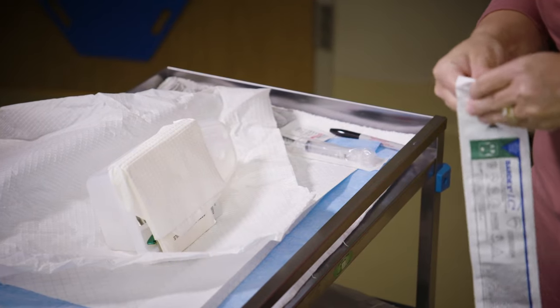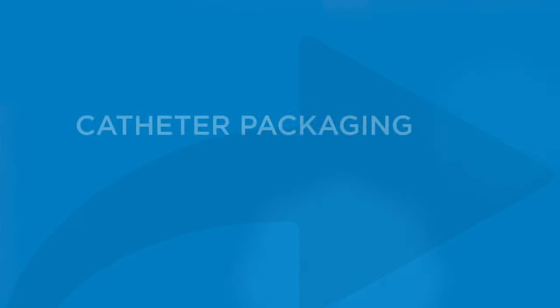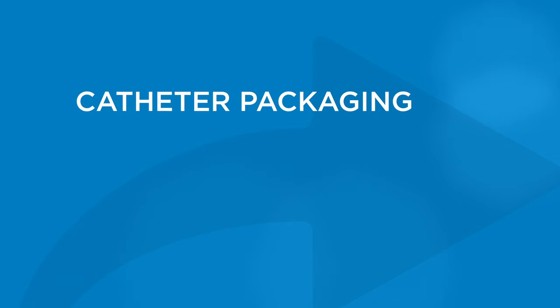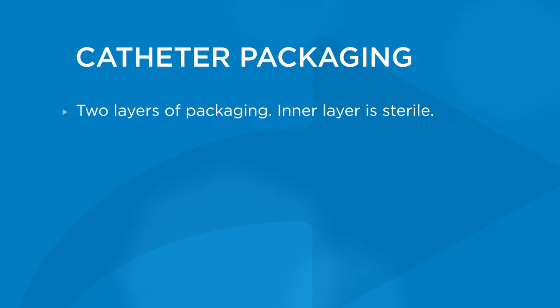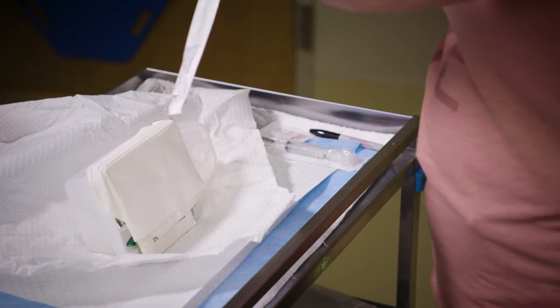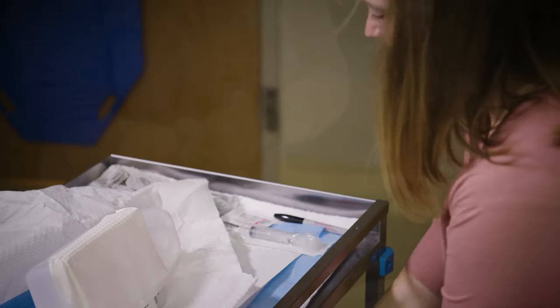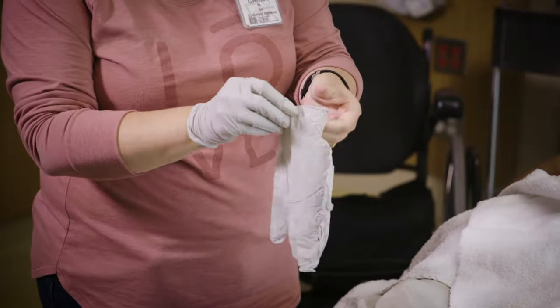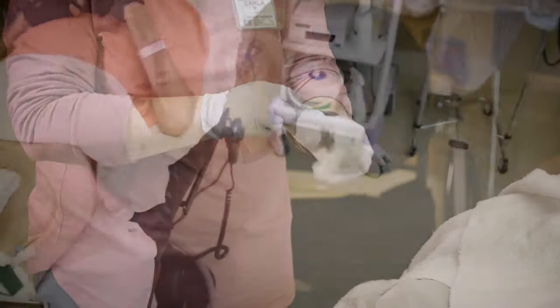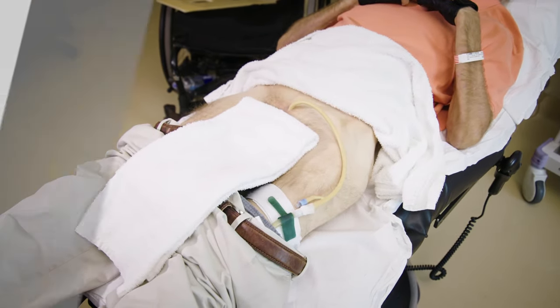Now, open the outer packaging of the catheter about halfway. There is still another layer of packaging around the catheter itself. This inner layer of packaging is sterile. Without touching the inner layer, drop the catheter onto the clean work area. Now put on a clean pair of non-sterile gloves. Place a clean towel on the lap of the person below the insertion site.